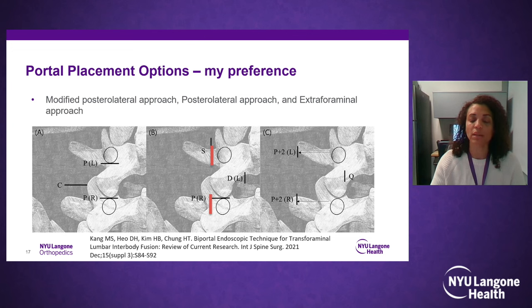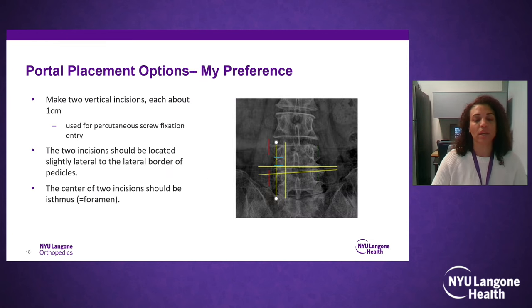from this angle, as opposed to, as you heard Dr. Kim, when you're doing a microdisc or a laminectomy alone, that you're going to be medial to the pedicle. So it definitely does feel like you're kind of looking up and over, but that works for getting your interbody in as well as getting access to the rest of the areas you need to decompress.